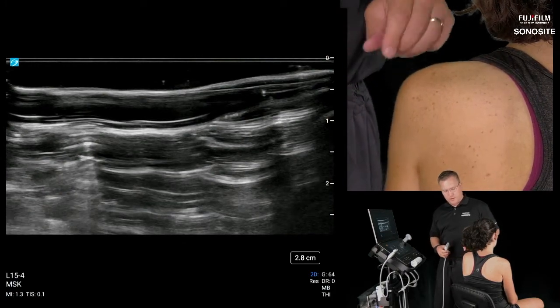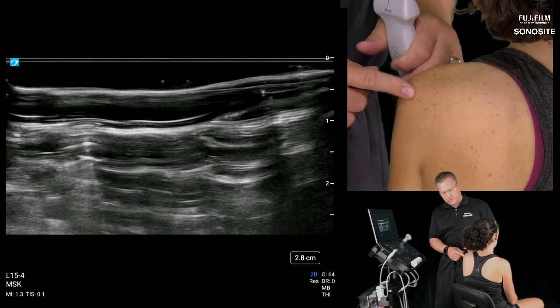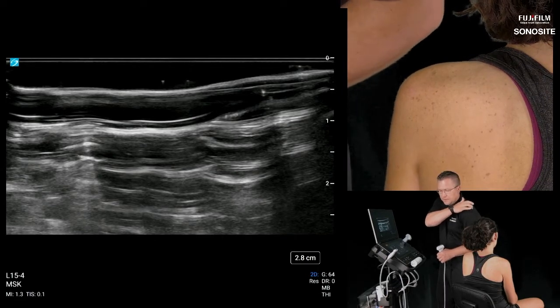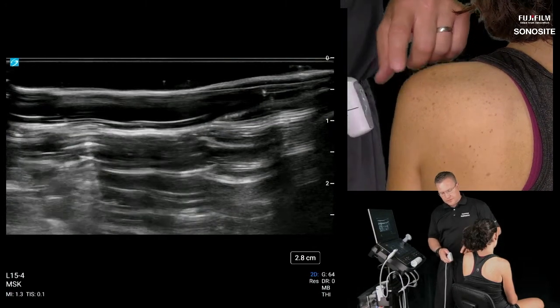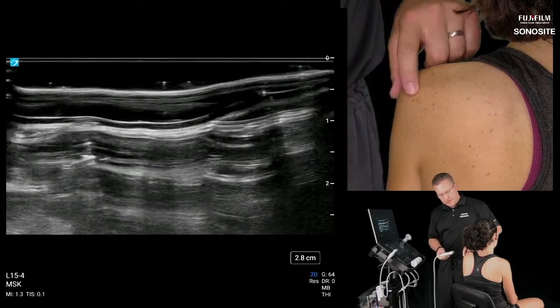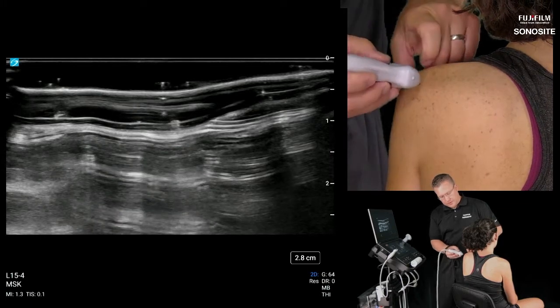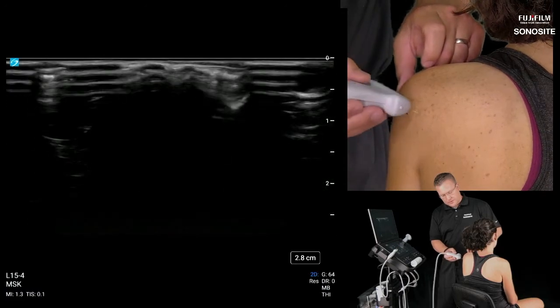But for now, I just want to point out my most frequently used palpable landmark, which you should always start with, a skeletal reference point if you can. This is that posterior lateral corner of the acromion process, and I just want you to reach back here on your own shoulder and feel for that little bony prominence, because we're going to use it for the majority of this exam. I'm going to keep screen left medial for this exam. What I like to do is palpate that bony landmark, set the upper part of the probe, this surface, in long axis across that lower edge of the acromion. So I'm actually physically bumping that up against the acromion. So I'm just going to set the transducer down right here.